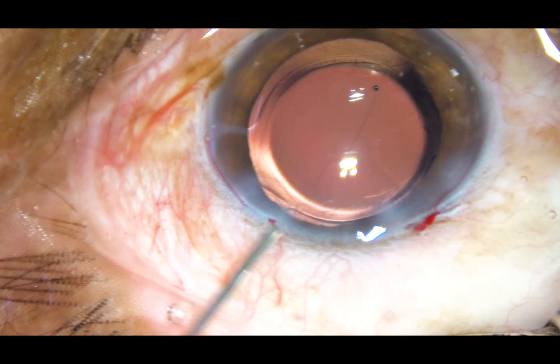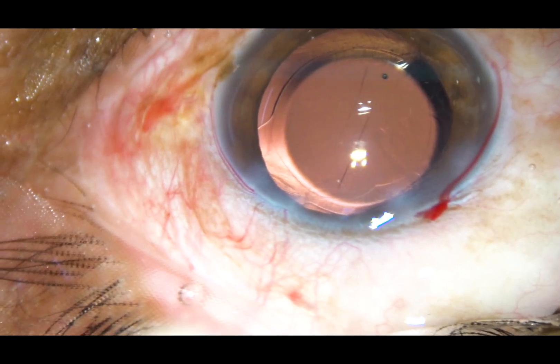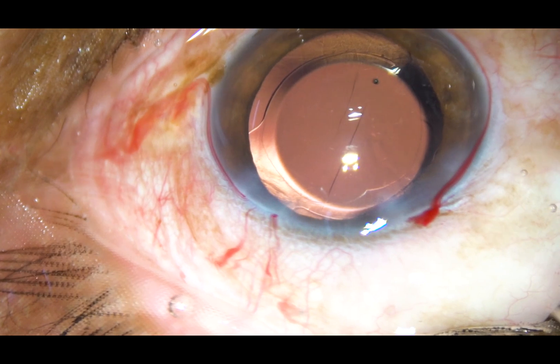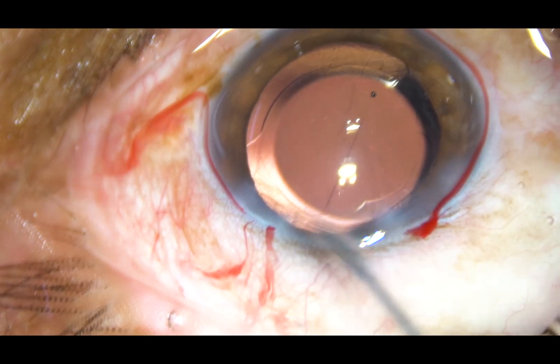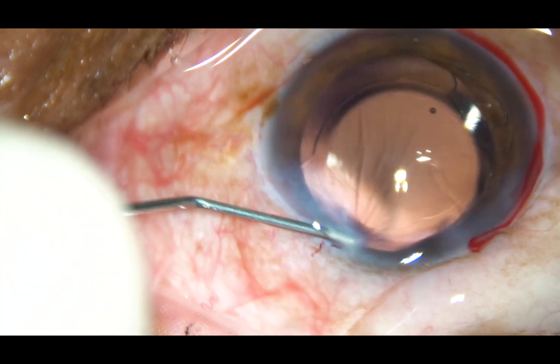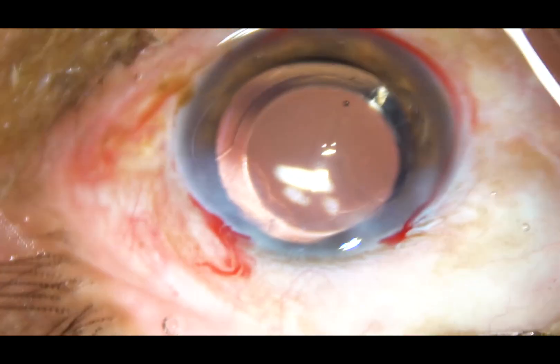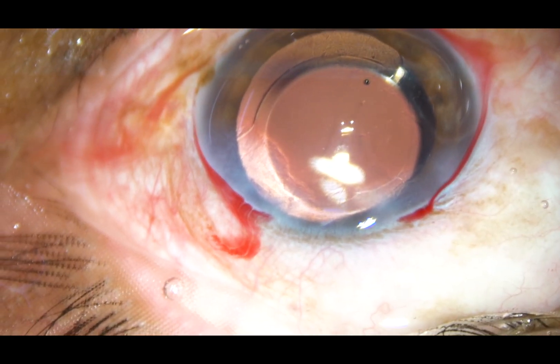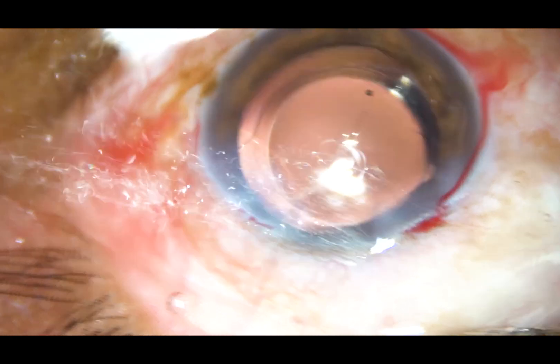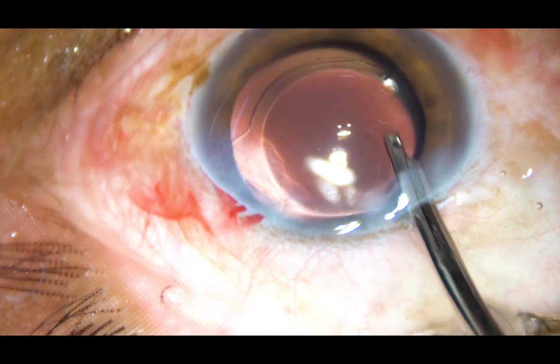The surgery is done. This is a bit of moxifloxacin applied. The side port is hydrated. This is the final clean-up of the anterior chamber — the fluid jet cleans the corneal endothelium of viscoelastic substance.